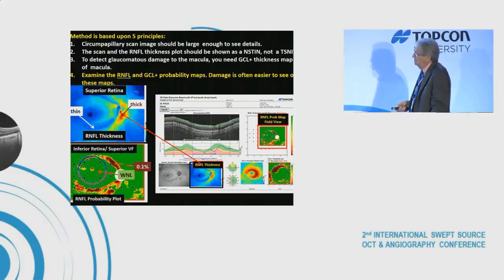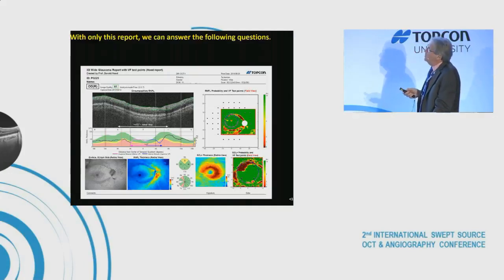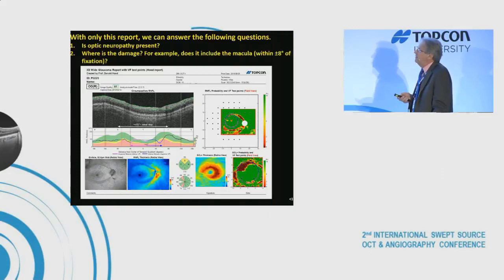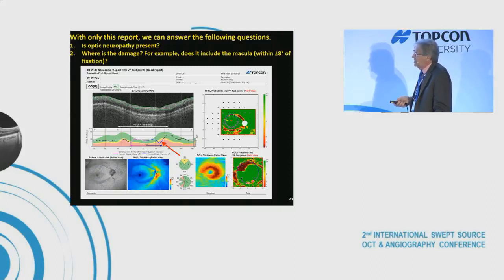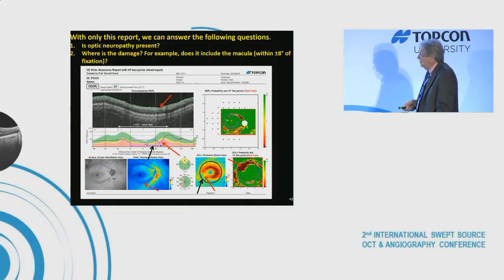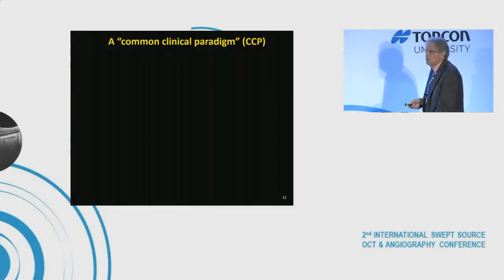With only this report, we can answer key clinical questions: is optic neuropathy present, and where is the damage — does it include the macula? In this case, there's macular damage dipping close to fixation, which may or may not appear on a 24-2. You can see it in the instant plot, in the probability map in field view, in the thickness map, and in the RNFL probability map.